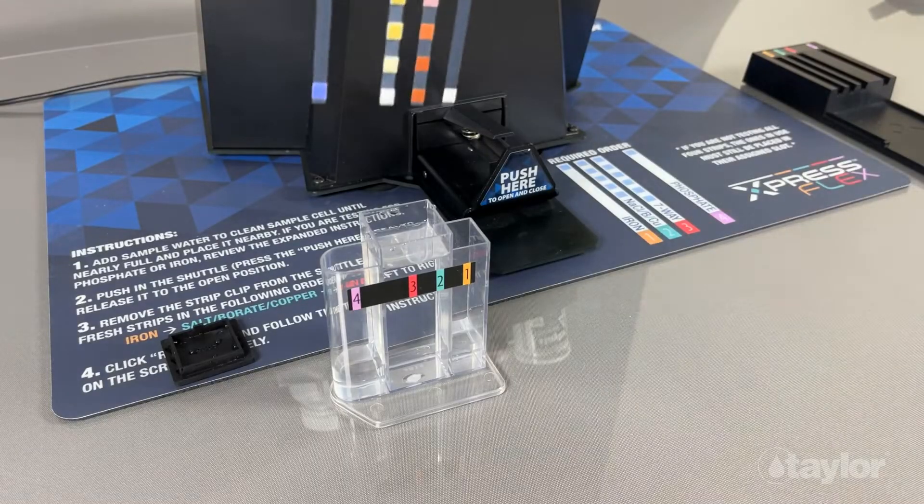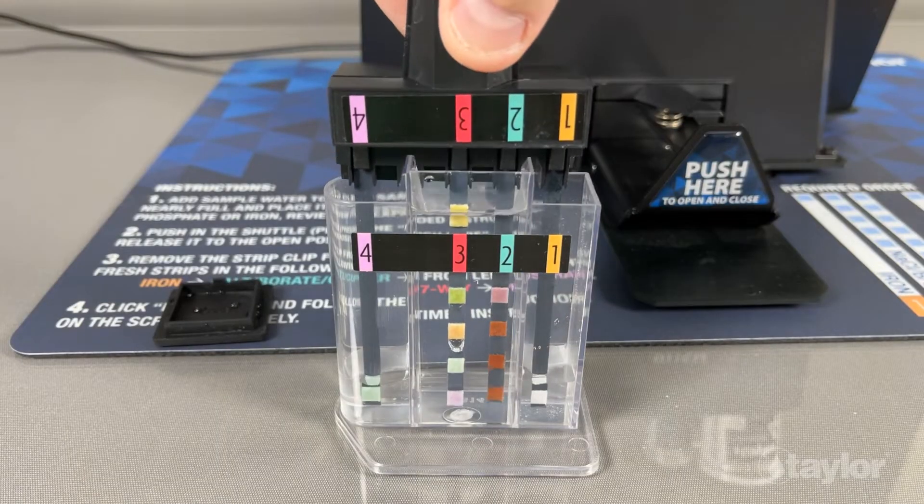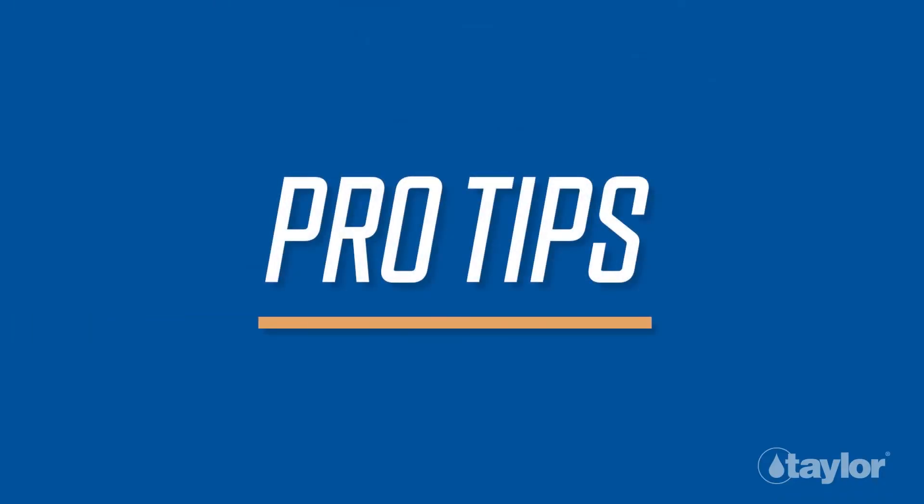In this video, we will demonstrate how to perform water tests with the ExpressFlex system and will present pro tips to help you get the most out of your testing experience.